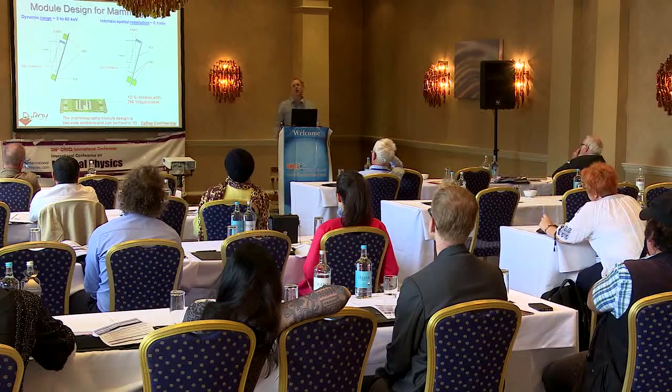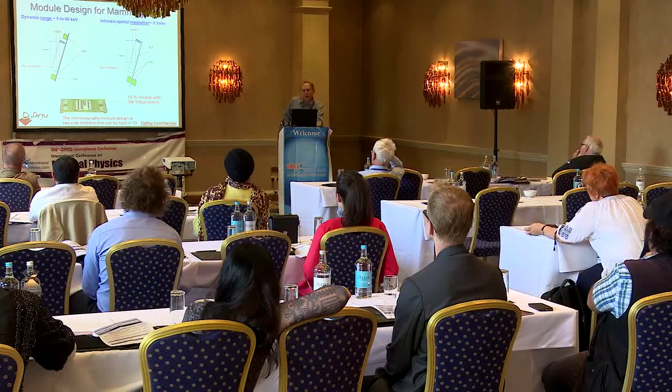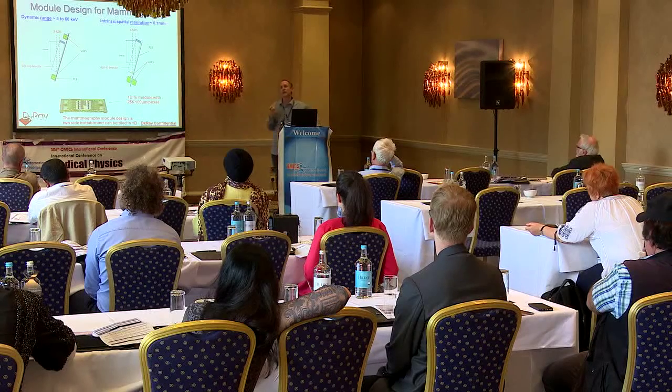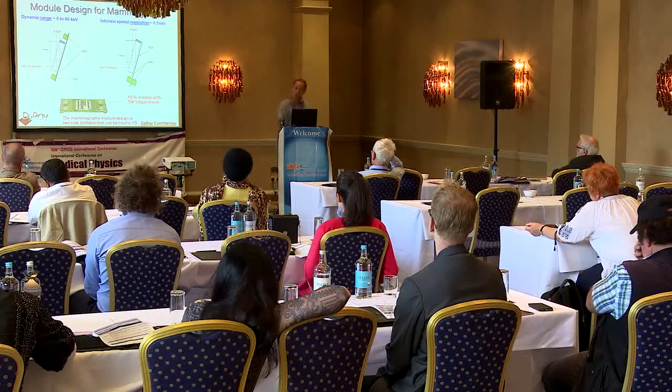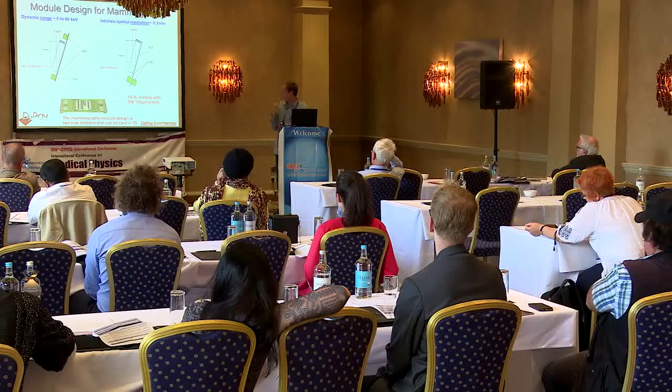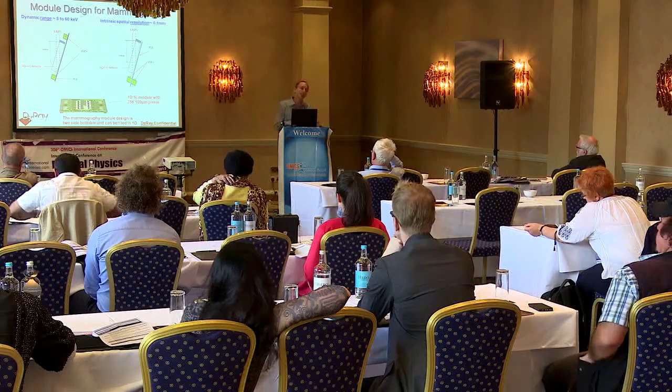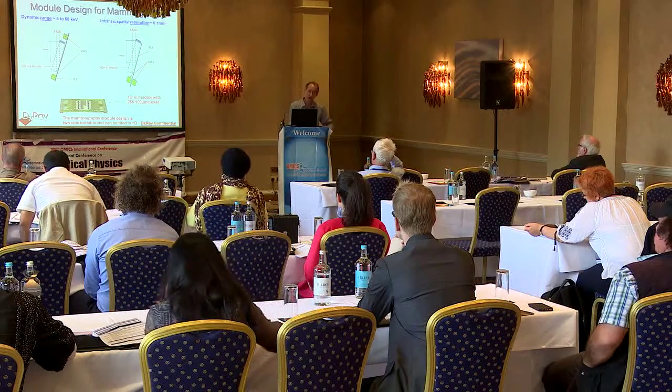Okay, and so I want to talk now about a third detector technology that's under development to try to bring spectral photon counting into mammography. Now, this is a place where this method can really have a lot of impact because it's exceedingly important to get the dose as low as possible.